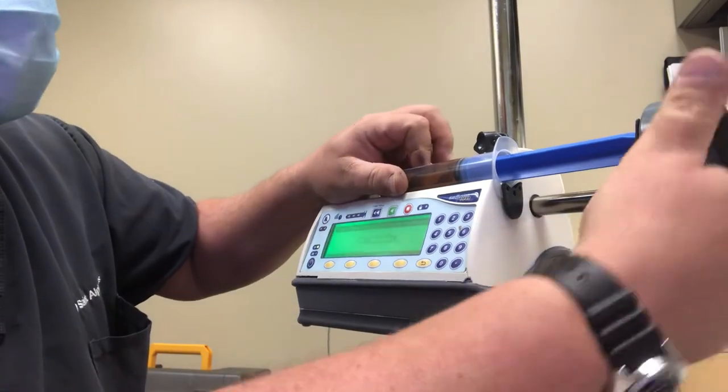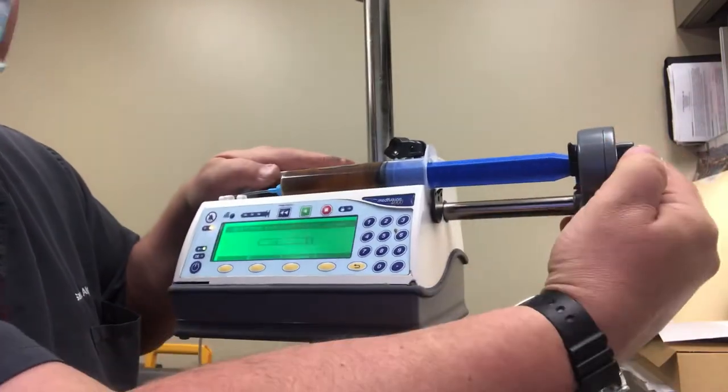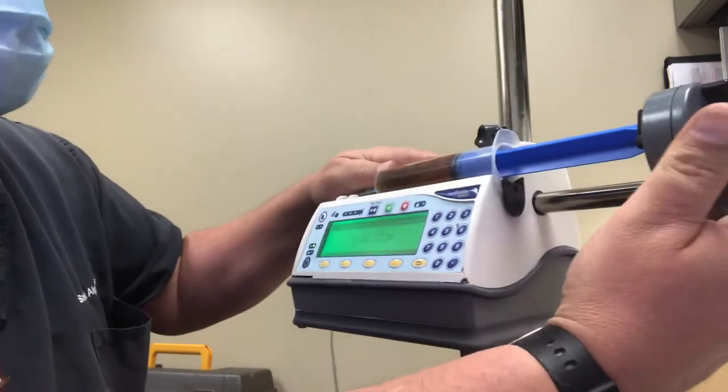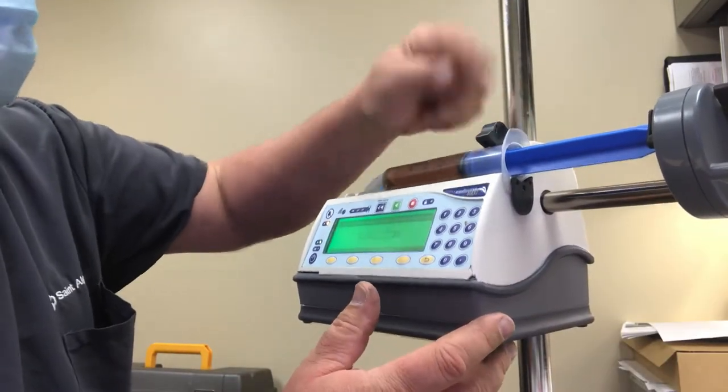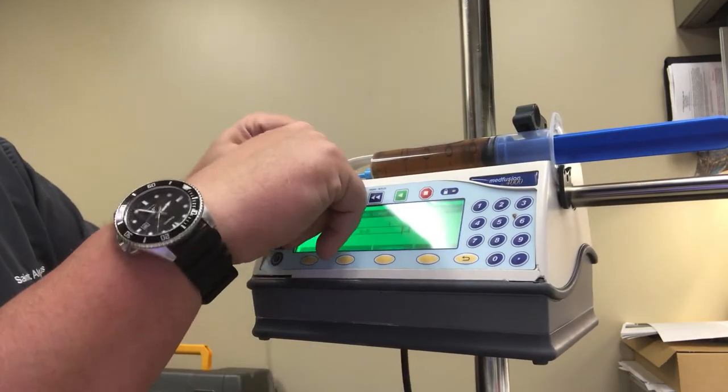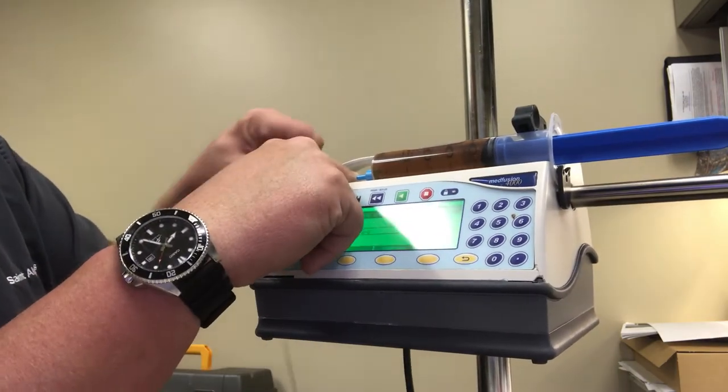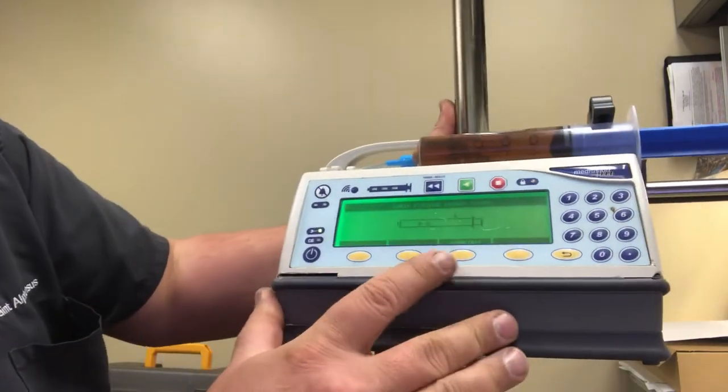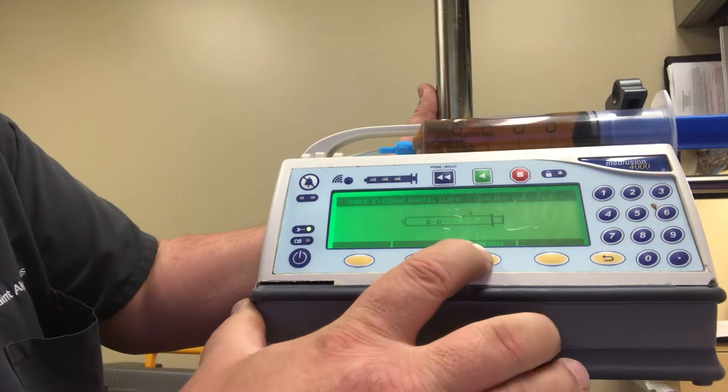So it goes in like that. You saw how I did that and I grabbed those two little things, grab the end of the syringe, that flips there like this. This weaves in and out of these to keep it from disconnecting. And now it wants us to confirm that the barrel is in there correctly.